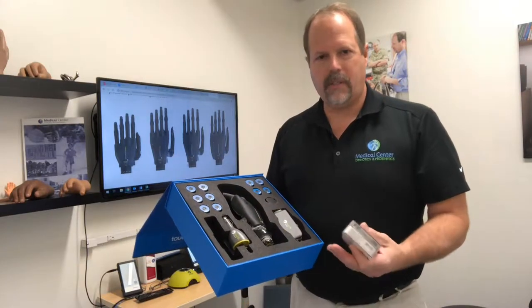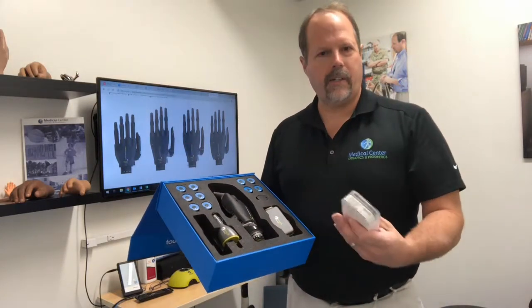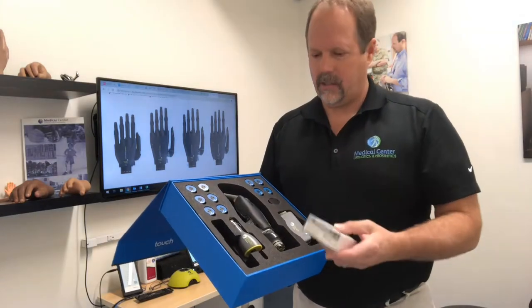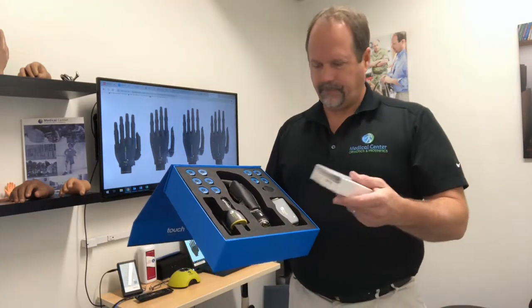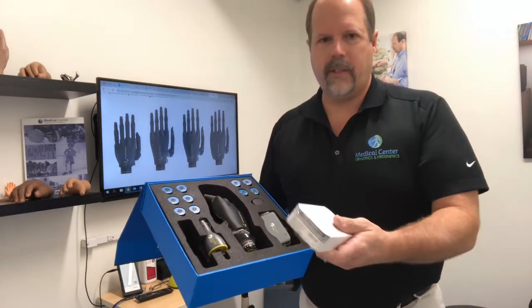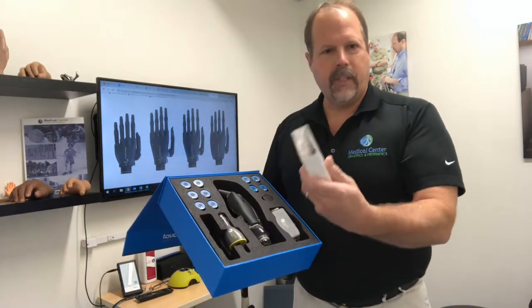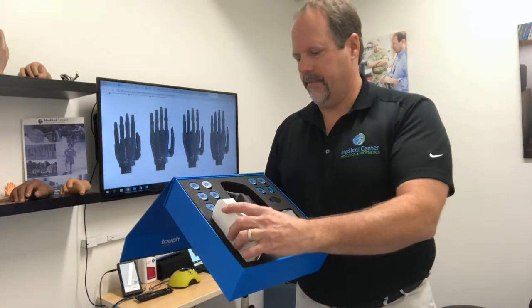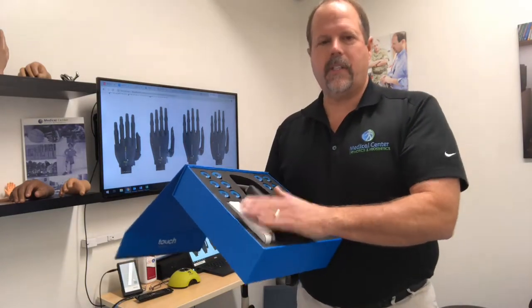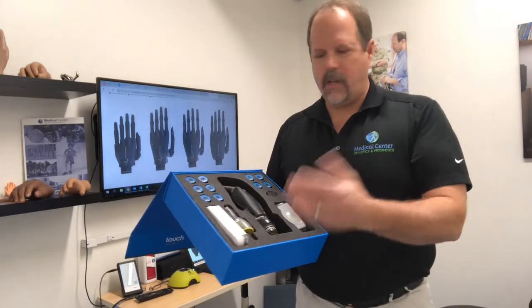They can change the grips, look at their EMG signals coming through the device to work on training at home, and a number of other things. They can set up different settings for work, recreation, or whatever they're going to be doing — making coffee in the morning. They can click on that and get four different grasps within each of those settings in the device. It also allows the patient to change grips in several of the ways that this device changes grip patterns.